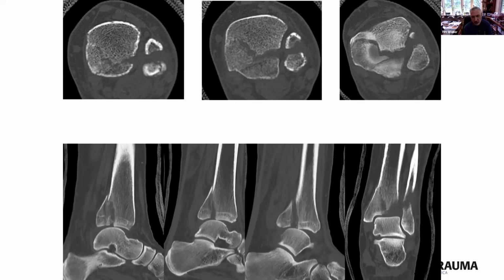Yeah, I just think these are super hard at this point, because getting that cleaned out is really the key. You can't get this closed down or get back to that normal ankle anatomy that I showed in my talk, those cross sections, which is really impressive when you look at the ankle in that view. To be able to close this down and get it back is really tough once you get that much callus in there. And on top of that, the clamp really has to go from back to front. It's just a hard trajectory to get and not crush soft tissues and not have a big clamp in your way. It almost has to be a plate reduction, pushing with the plate, but these are hard. I think the biggest question is, do you try to do it all through a posterolateral approach?